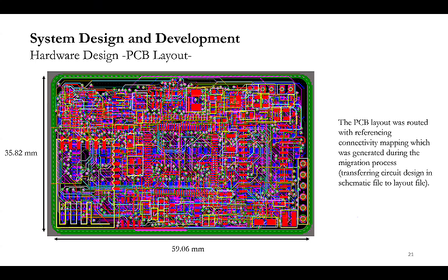Yeah, but STM32 has a nice IDE, and the documentation is super, and there are lots of users in the world using it. Documentation is key in a microcontroller, like reference manuals, so STM32 is really powerful in that. But there are lots of microcontrollers in the market. I'm sure Chinese and other versions also work.